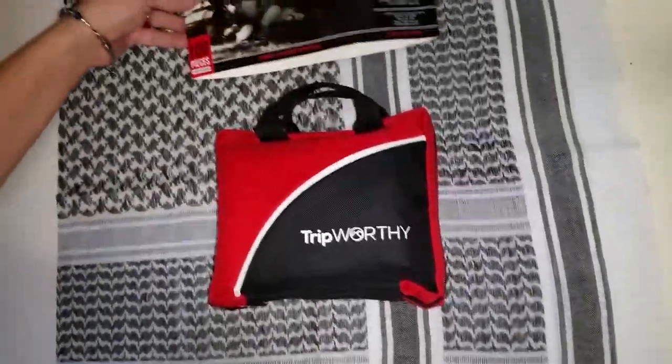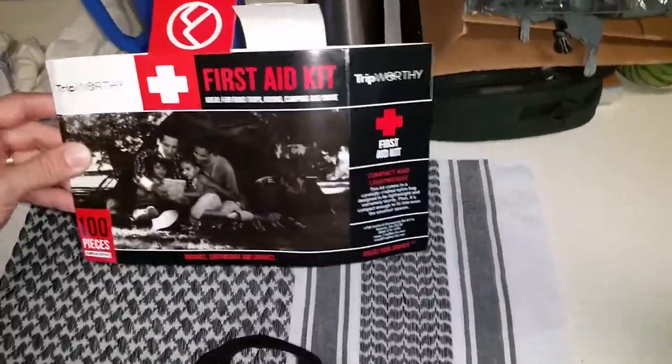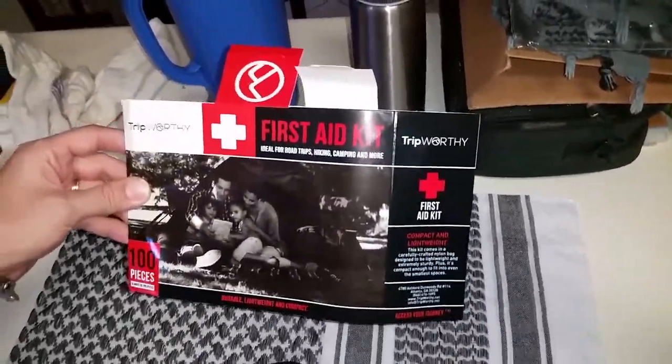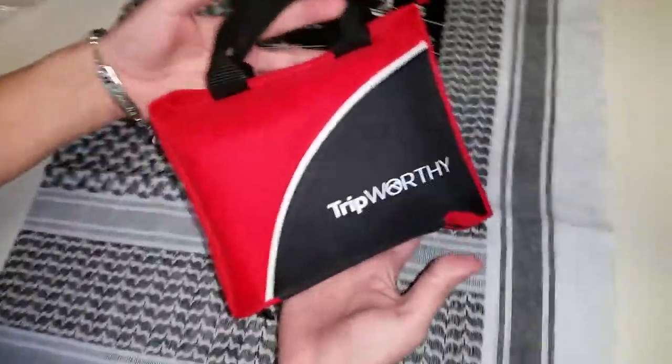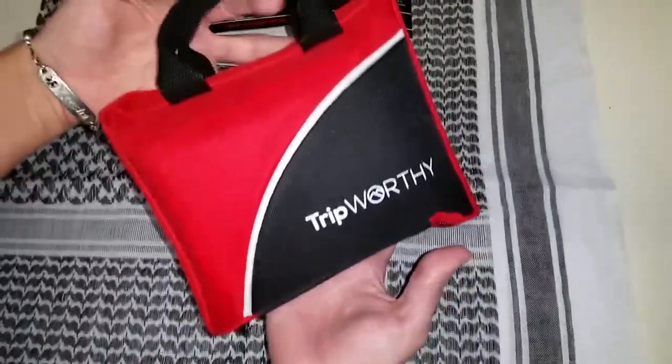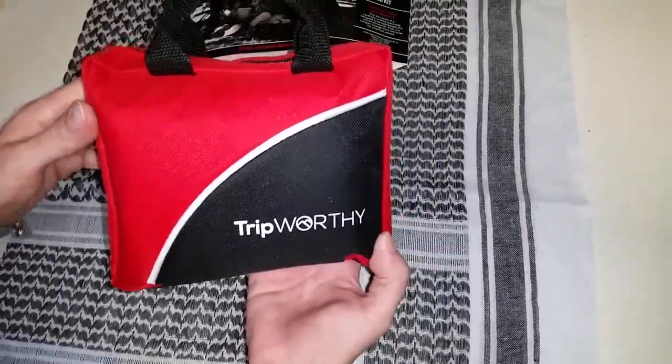Hi everybody, this is a review of the Trip Worthy Compact 100 piece first aid kit. This is the size of it, so it would be really good for in a car, glove compartment, or in the trunk, or if you want to take it on a road trip or a camping trip.